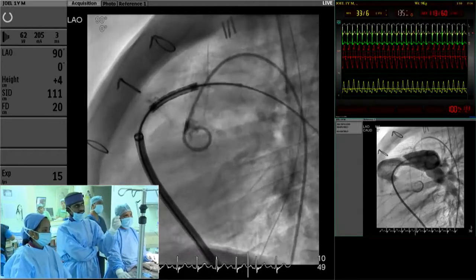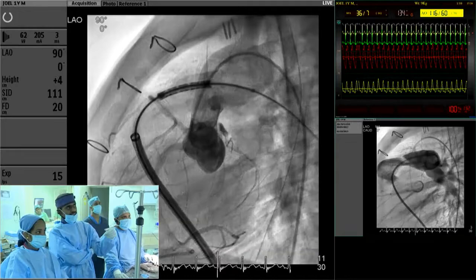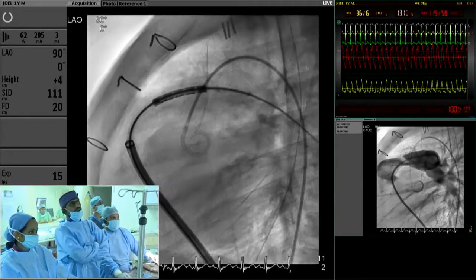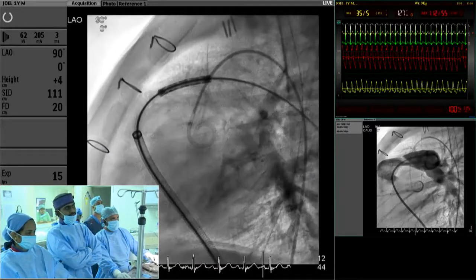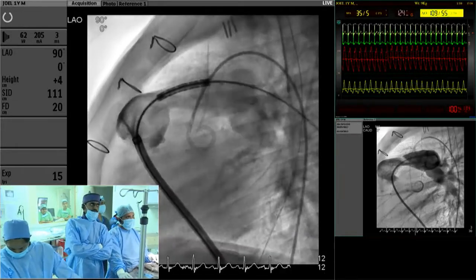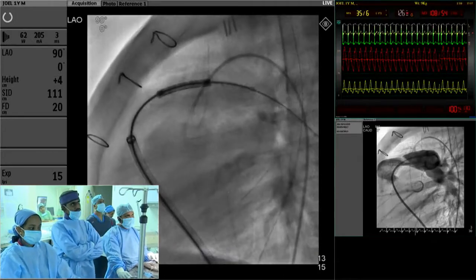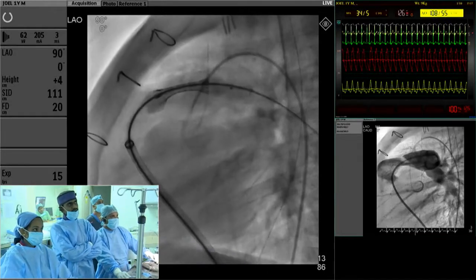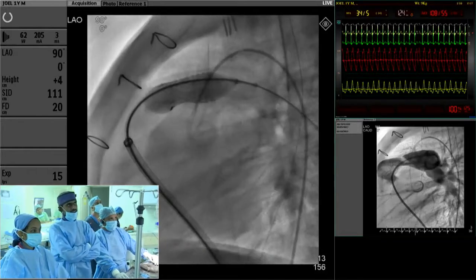So we pushed the stent marginally inside. Next. So we repeated. Now we are a millimeter above the coronary artery. Then next picture. We repeated to check whether we are safe on the conduit. We found that our proximal end is matching the stenotic segment. Next. So then we expanded the stent with a gentle forward push so that the stent does not come back and hitch against the coronary.